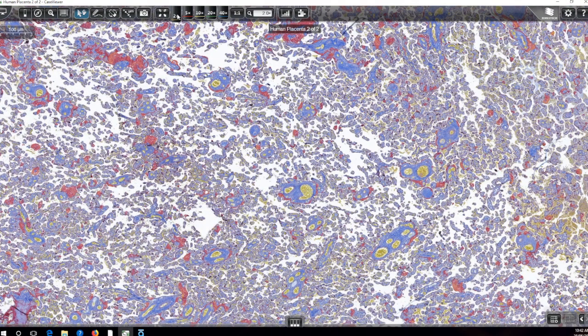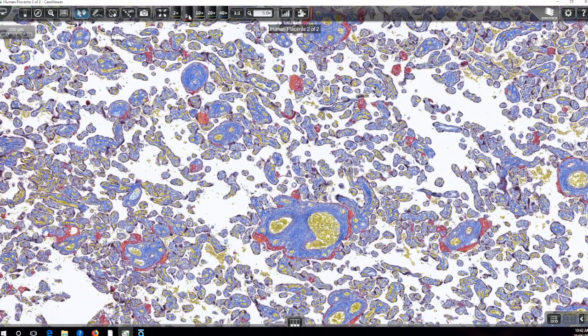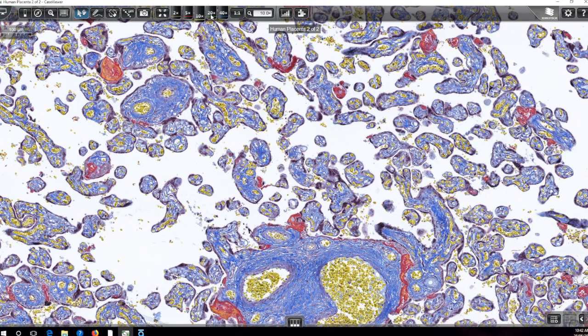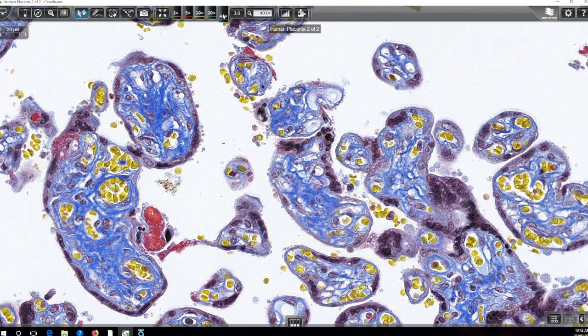So we can do that by clicking on these virtual lenses, so 2x or 5x or 10x, etc. And as we begin to increase the magnification, you can see that's a really nice outcome. For the MSB, we've got some nice red fibrin, vibrant blue collagen, nice strong nuclei, and some yellow red blood cells.